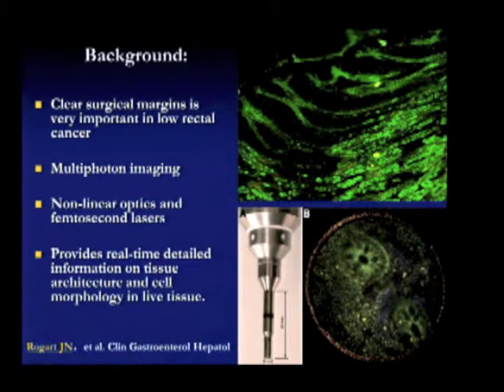And this picture is from Yale University in 2007. He used the multiphoton probe to show rectal mucosa in rabbit rectum.